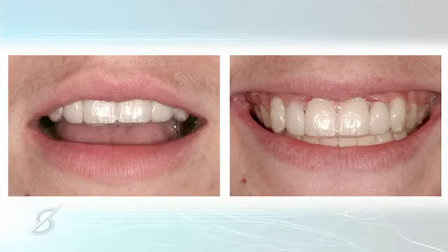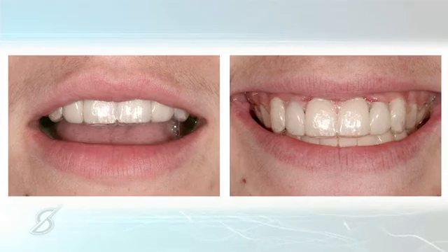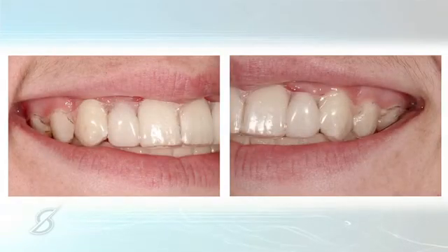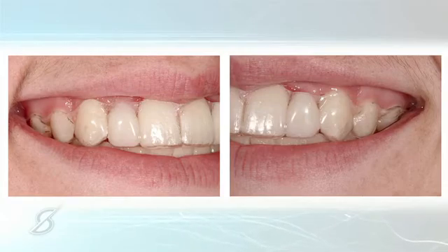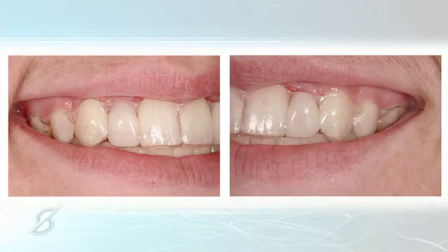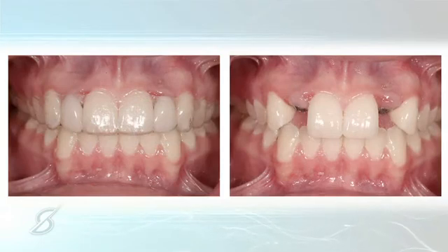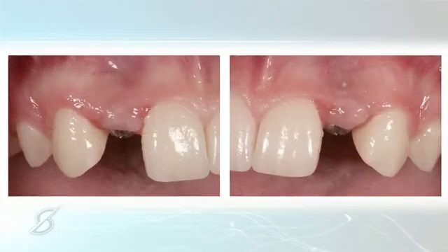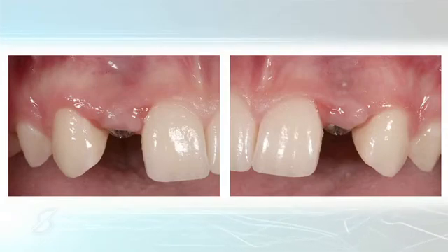But when the Essex retainer was made, the person that made it didn't trim it up short from the gingiva. And so it's actually digging into the connective tissue grafts over both lateral incisor implants. When you take the Essex retainer off, you can see the tissue's pretty angry. There's also a lot of tissue there. And so I did the impression, which you saw earlier, where I injected anesthetic into the tissue, took the abutments off. And now we've got temporaries made just like you saw on a model where the tissue was carved.